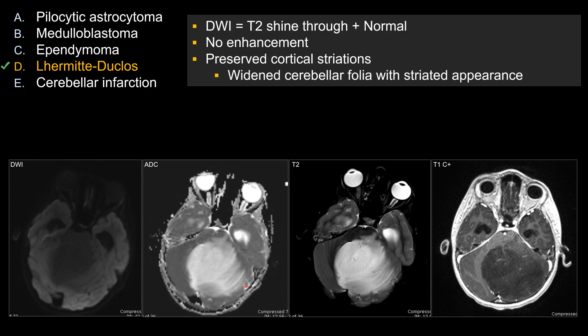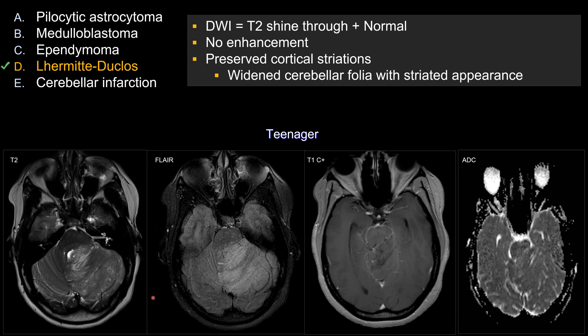In this case, it is somewhat challenging because it is very reasonable to consider that this could be a low-grade neoplasm — low-grade in the sense that there is no restricted diffusion. You may also consider whether this could be a cerebellitis. In that case, patients tend to present with acute symptoms. In this different patient — an older teenager — you can see on the diffusion-weighted sequence and ADC that there is no restricted diffusion; in fact, the ADC looks completely normal.